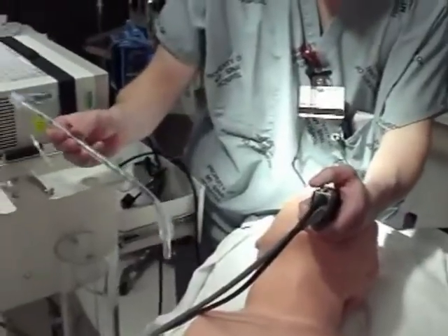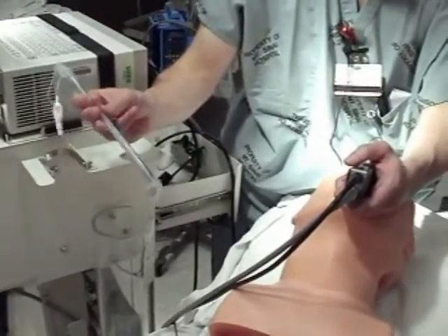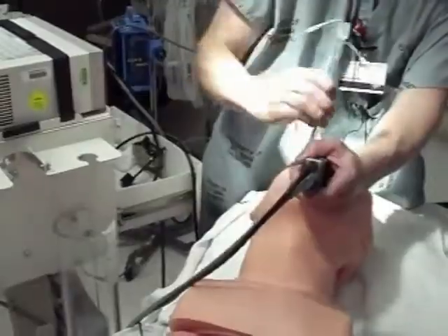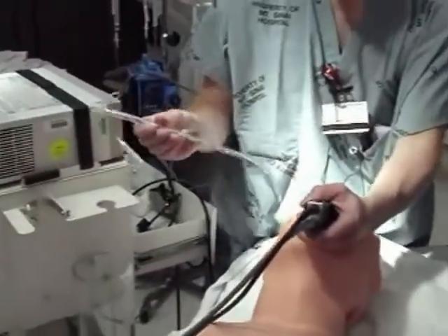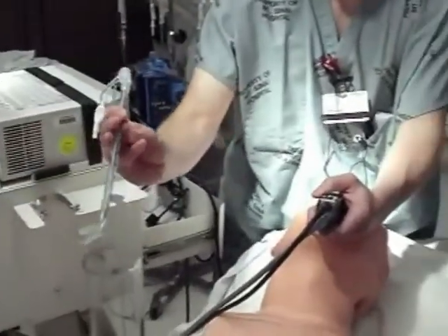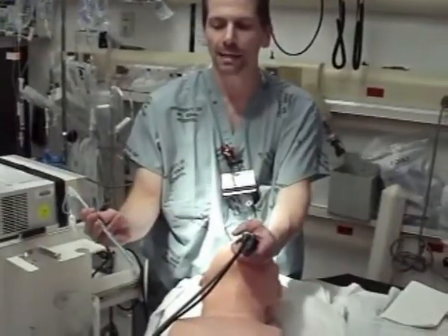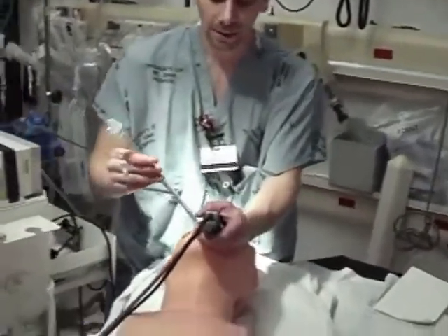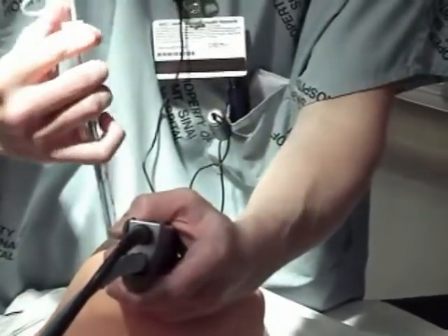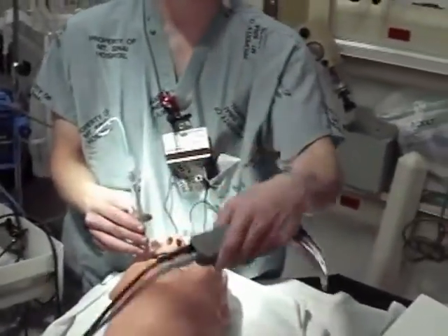Coming in horizontally gives you full control — you can go up for an anterior larynx or down for a posterior one with just tiny finger movements. You don't have to make great big motions pushing against the back of the throat. Come in horizontally, and only at the last second tilt the tube in. Same technique applies with the bougie — horizontal all the way, tilt just in front of the cords, see the tip at the cords, and only then go forward. Sometimes you'll get the tip through the cords and can't advance — have your partner pop the stylet out about a centimeter and you'll be able to advance all the way in.